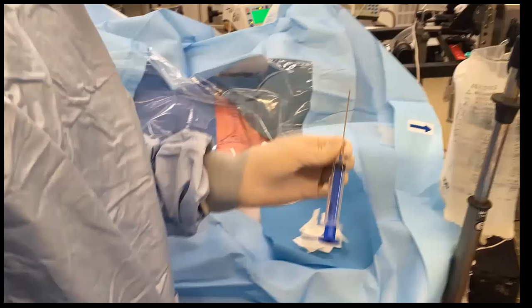The following three-and-a-half minute video shows the process in its entirety. The patient has already been positioned, the site cleaned and draped. This patient is under general anesthesia. If you're performing this in a conscious patient, you will need a syringe with local anesthetic and a 25-gauge skin infiltration needle. The skin puncture point and subcutaneous tract to the clavicle will be infiltrated using the same needle approach as described for the actual procedure.